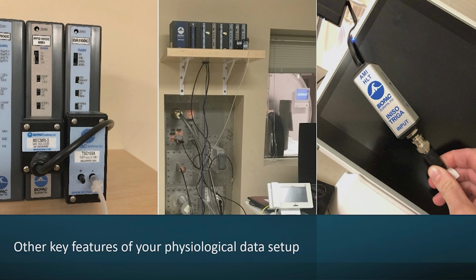And then lastly, one of the things that you do want to do with physiological data is collect MR triggers. There's typically a little trigger box that connects to the scanner and then to the physiological data equipment. This allows you to sync the data collection with the MRI and the TRs that are happening, so that you can take the physiological data within the TR around the image that you're acquiring and use that for whatever you need.